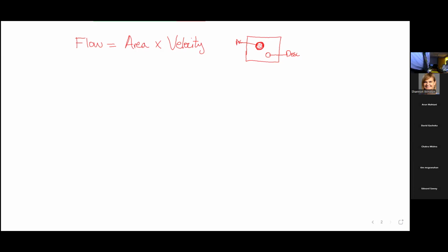What's kind of interesting is that with MRI, within the bore of the magnet, so now over here, we're going to draw an MRI scanner, and here's the bore of the magnet. Within the bore of the magnet, there are these gradients that sit around the outside of that thing.